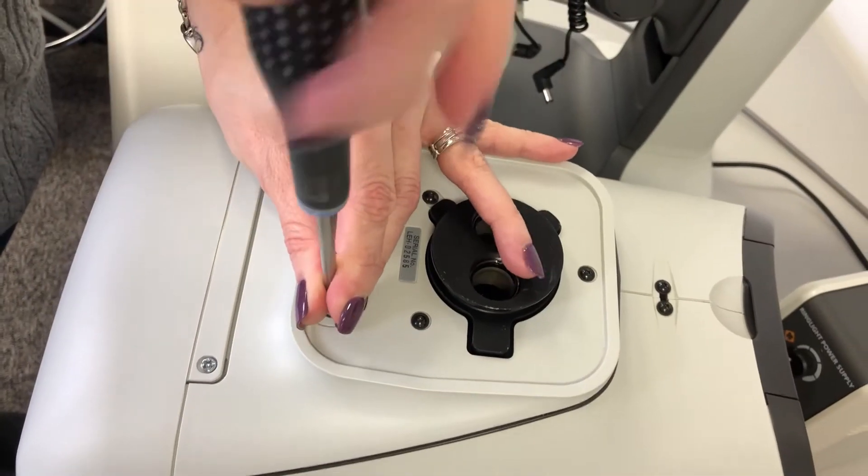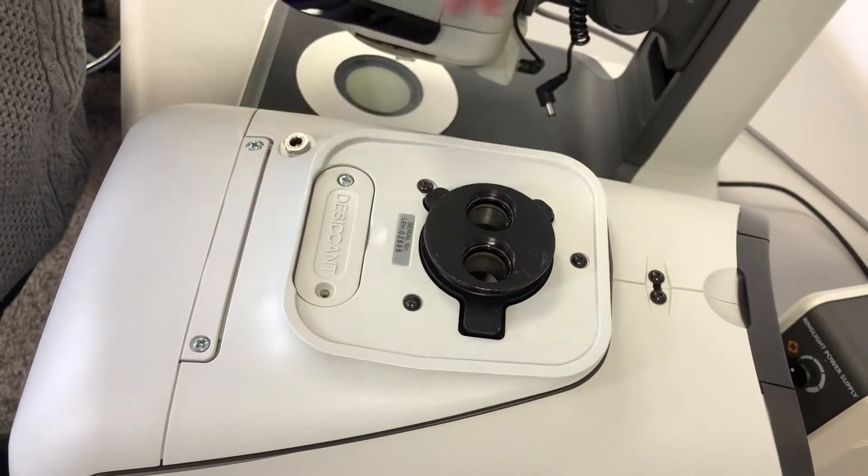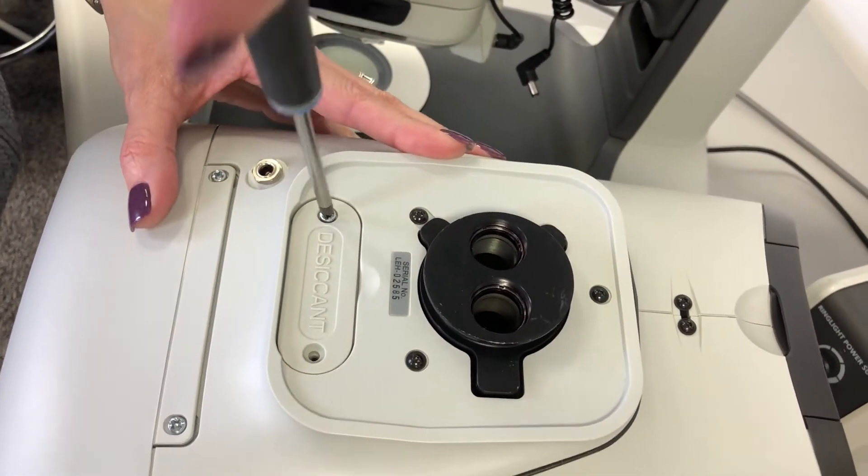The purpose of replacing your desiccant cartridge is to help control humidity within the Lynx scope. This will keep the system dry. If it turns pink, that means it does need to be replaced.